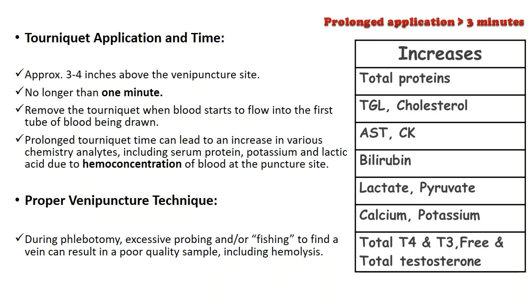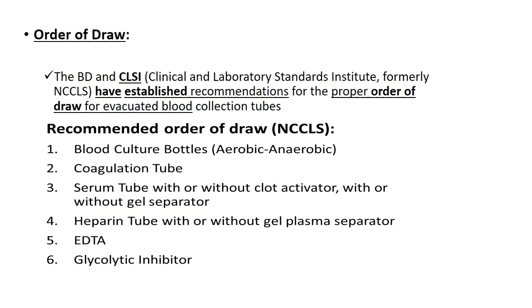Proper venipuncture technique is needed. There should not be any double prick, and no need for excessive probing of the area, because otherwise it is not only painful, but it will also lyse the blood and hemolysis will happen. Order of draw is very important.